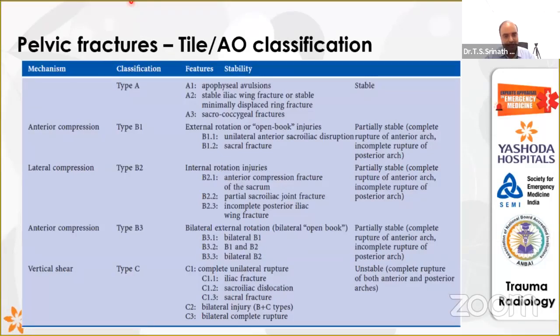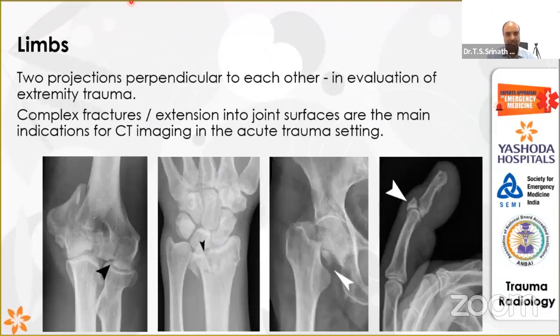Then you keenly observe the X-rays for pulmonary contusions. That is your next thing which you have to keep in your mind and say that, okay, this patient can have pulmonary contusions. Subject these patients to a CT scan, no harm in it, so that you pick up whether there is a hemorrhage or a contusion and what kind of treatment is required. Because again, you have to counsel the patient attendants, because if there is a pulmonary contusion or hemorrhage, the length of stay in the ICU will be more and infections will be more. So you have to start your antibiotic early. So this is how an emergency physician should think in the emergency department.